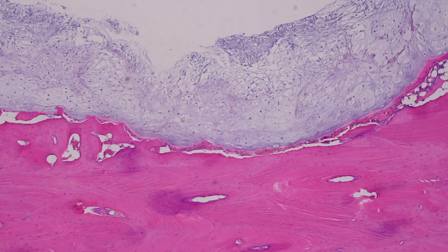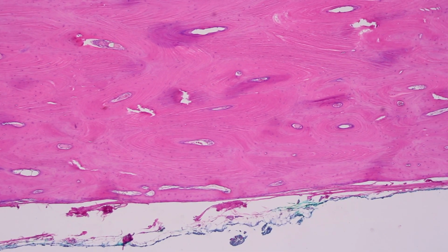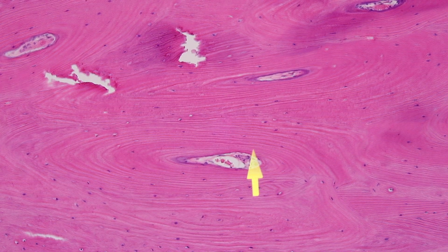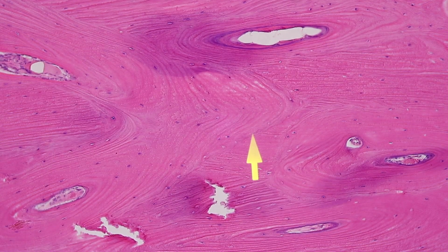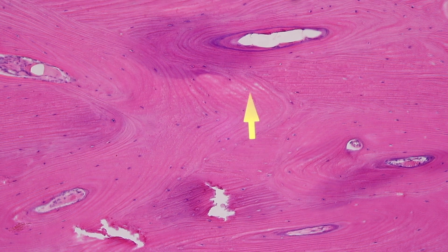The one thing I want to show is this. We are looking at the cortex here. Remember from our first lecture, this is where our circumferential lamellae are. Here we have a nice example of our concentric lamellae of this Haversian system. Here we have this aggregate of lamellar bone, that is the interstitial lamellae.